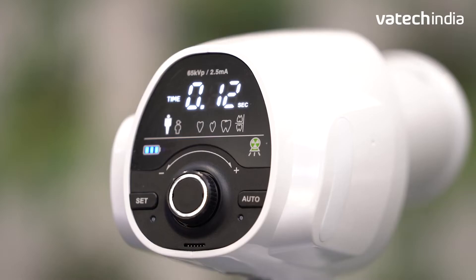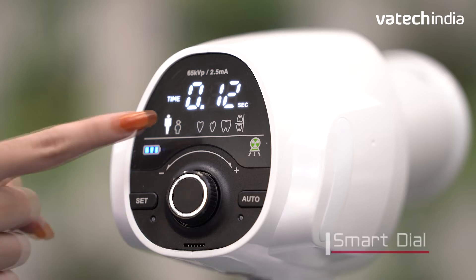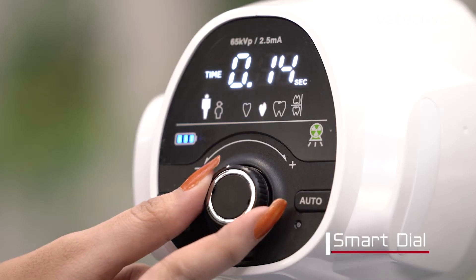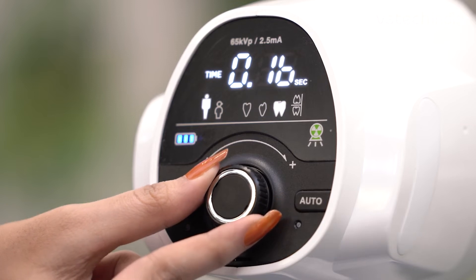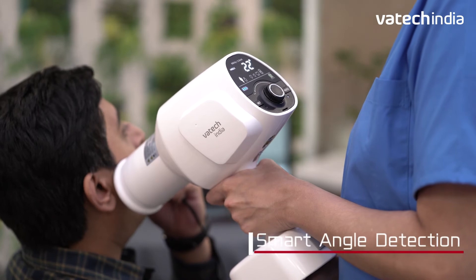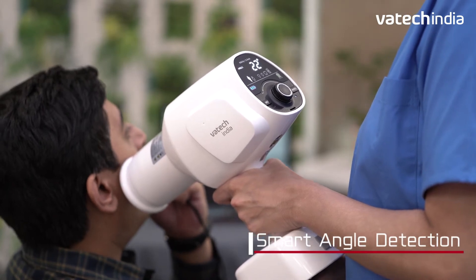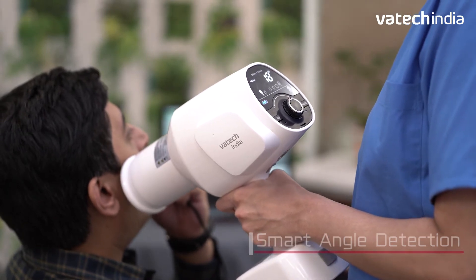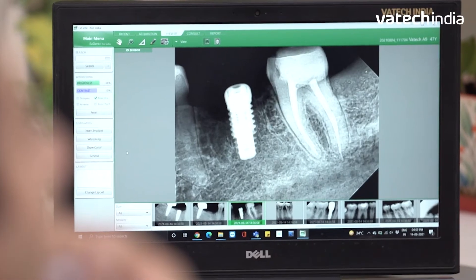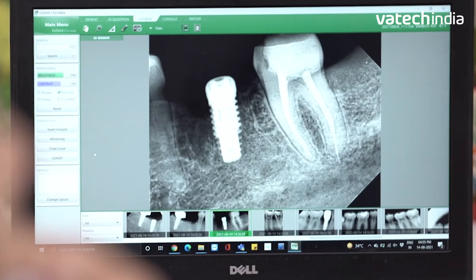Another innovative feature of EZ-Ray Air Plus is the smart dial, offering the ability to set regular functions as a customized preset, doing away with the need to change settings each time you use it. The built-in smart angle detection can automatically detect the area of interest, indicating the correct angle of exposure to achieve the desired clear images instantly.